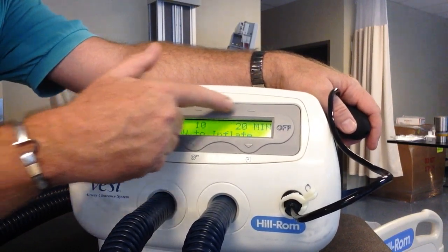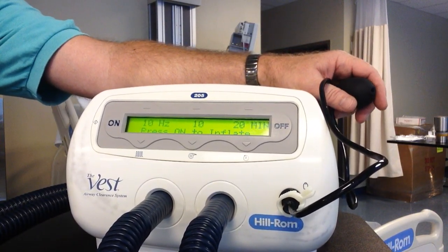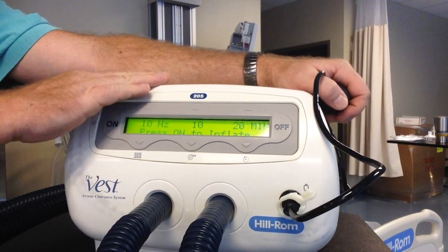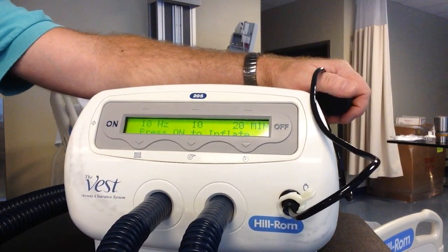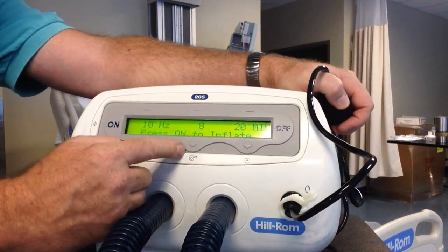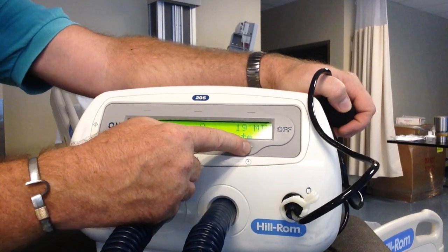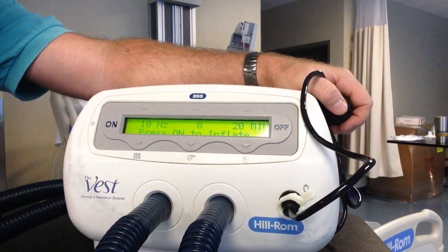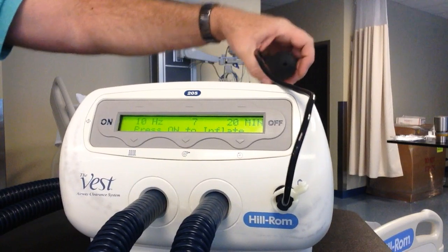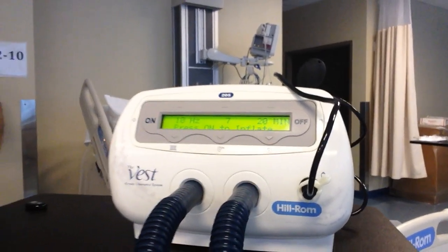Then it says 10 hertz, 10, and then the minutes. The hertz is basically how many times a second it's going to beat. So don't have to worry about that. So this is how fast it is going to hit, like this or like that. That's all hertz are, is how many hits per second. The 10 is how hard the hit's going to be. These little buttons are arrows up and down. And then this one will determine how long the treatment is. 10 minutes, 15, 20, whatever. So we're going to leave it here, 10 hertz, 7. And a lot of times the patients who use this already know what works for them, and they have their settings.